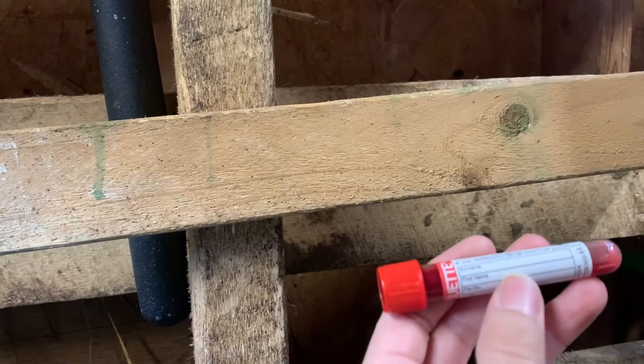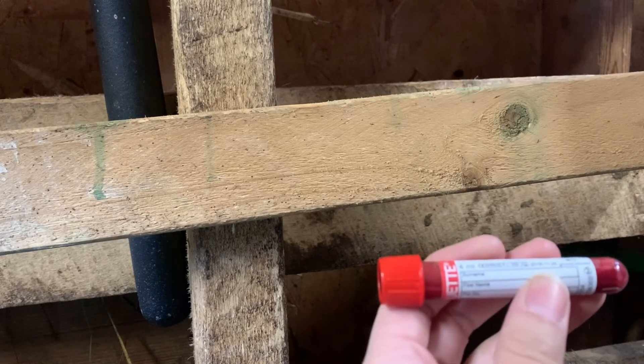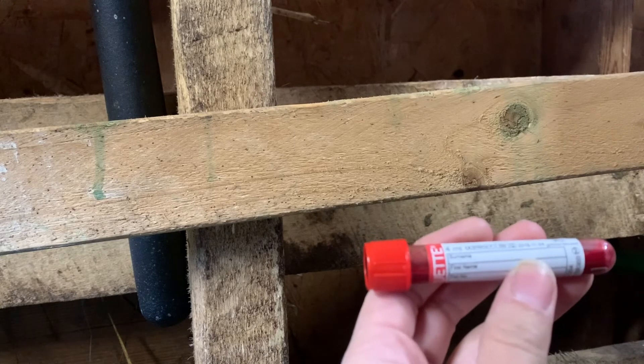On this label we're just going to put 'Daisy,' and then on the form we're sending into the company we'll put all the other information. As you can see, it's pretty easy. This is our first time drawing labs — I watched a couple of videos on YouTube and that's it, so it's pretty easy.